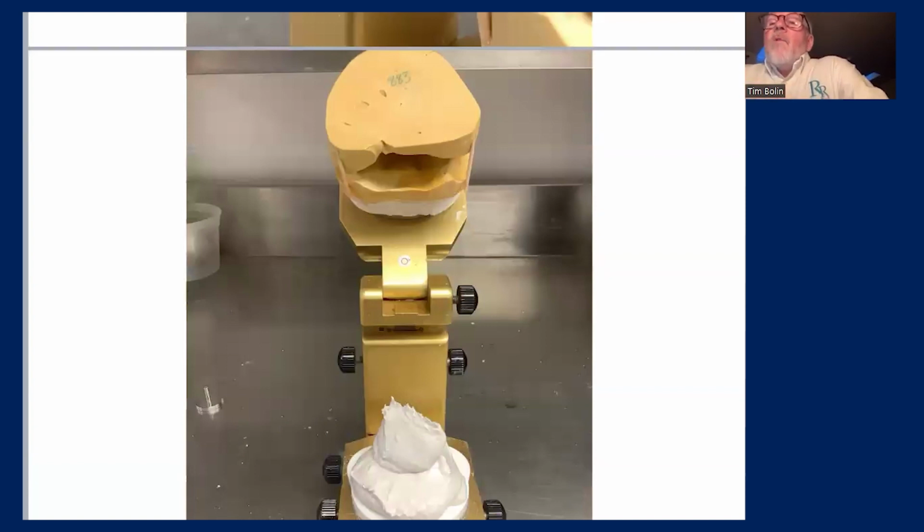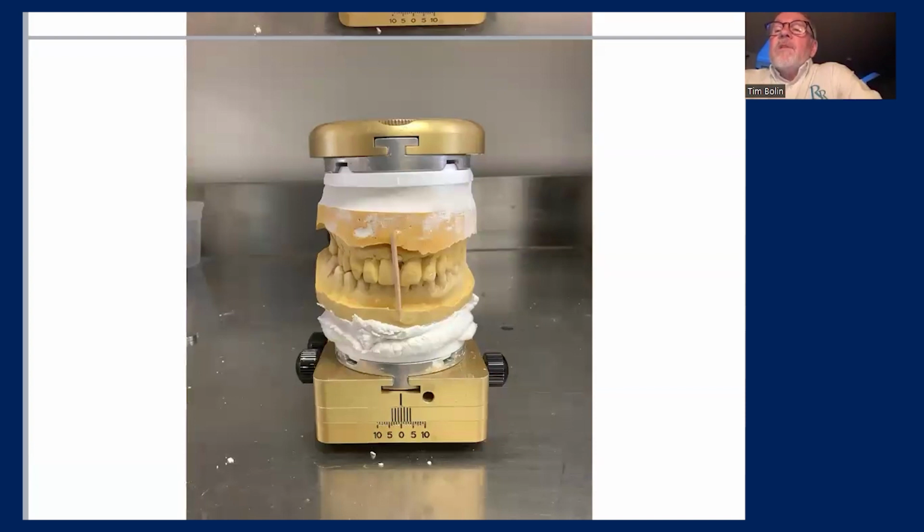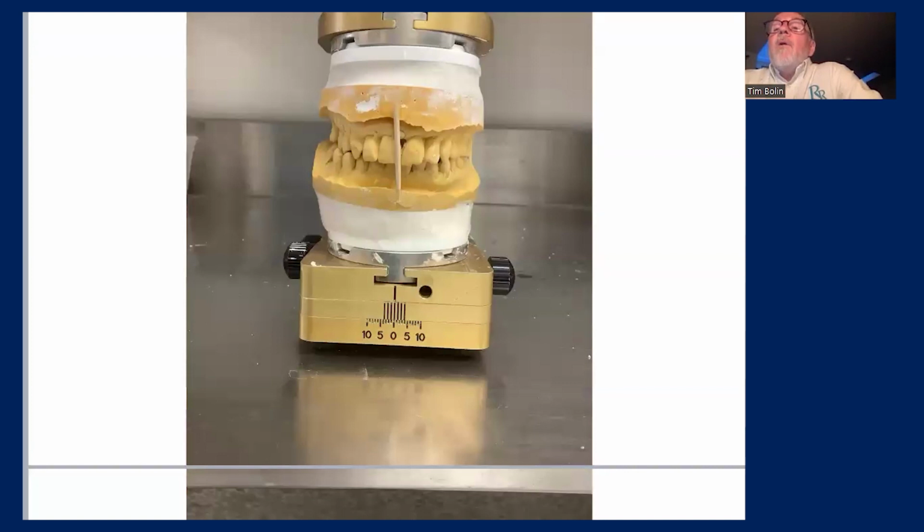We're going to mount that lower model in that position, that 0 mark. Just showing it getting squished down. Then we'll clean it up just a little bit. This is in-house, so I don't have to make it too pretty. Now, you can see the overbite with this particular case.